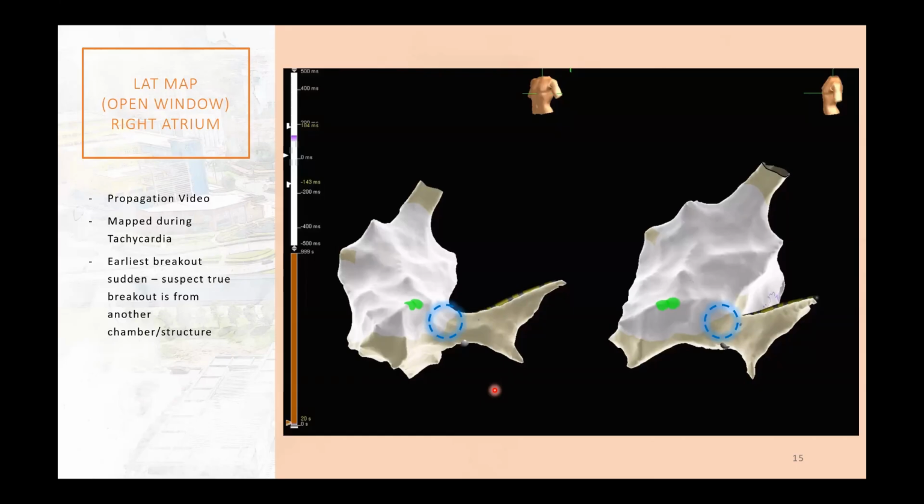But there's a concern Dr. Park is mentioning. There's a posterolateral branch of the right coronary artery crossing right behind it. In the old days we did non-irrigated ablation, which is a more resistive burn, so lesions were not deep enough to cause any trouble. These days, with irrigated ablation, you're going to go through. Many patients have an asymptomatic stenosis of the posterolateral branch. So that's one of the reasons I said earlier: you map three sites first before you decide what to do. And we should do a coronary sinus venogram as well, so you know exactly where you're mapping.